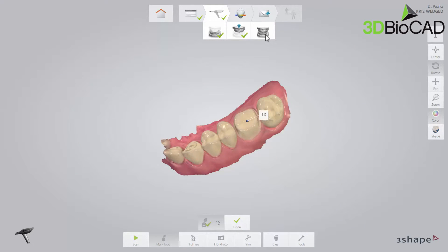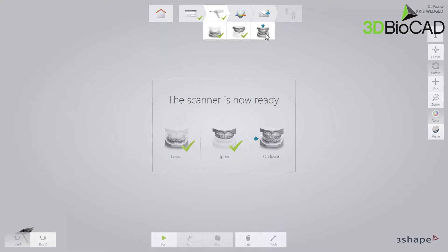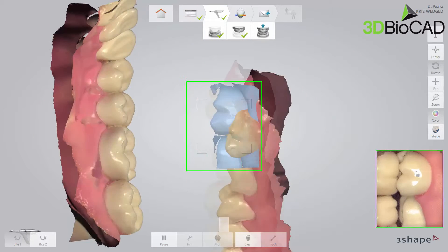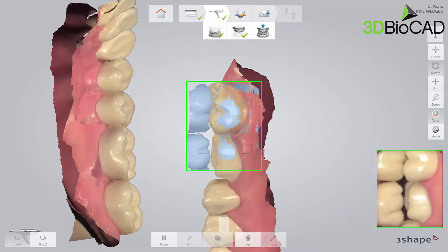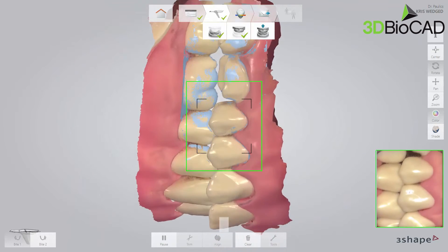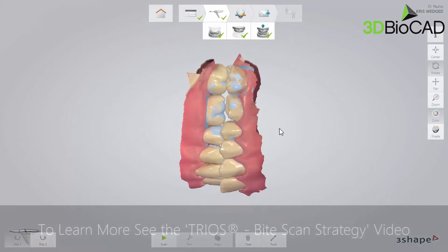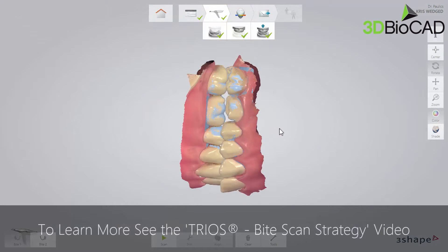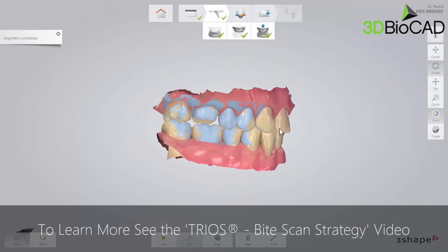Now move to the bite scan page. Insert the scan tip to the second molar on the buccal side. Ask the patient to bite. Scan 3–4 teeth until the upper and lower arches snap to the bite scan. The light blue surface indicates the surface covered by the bite scan.